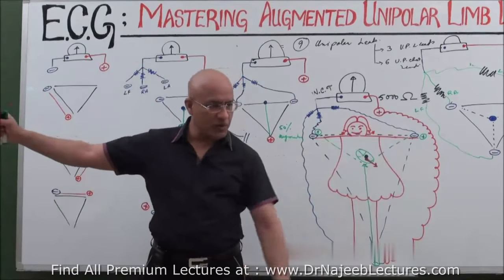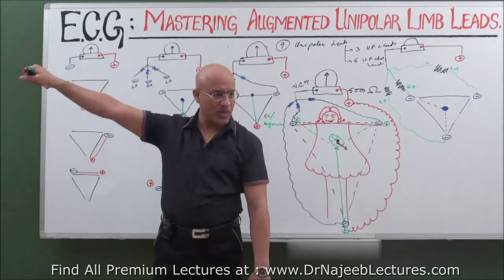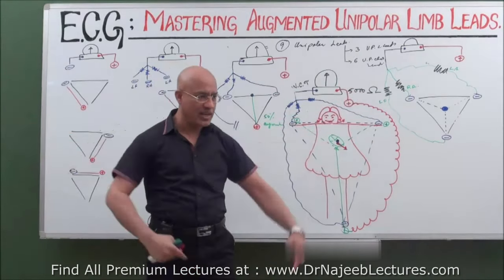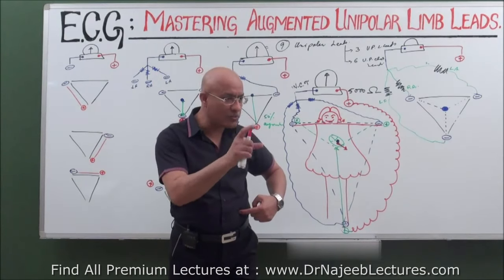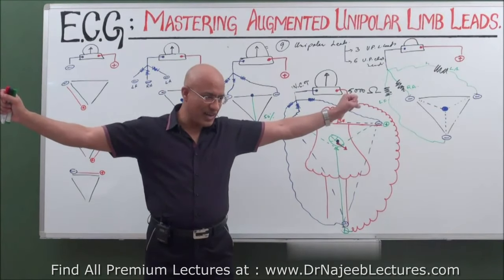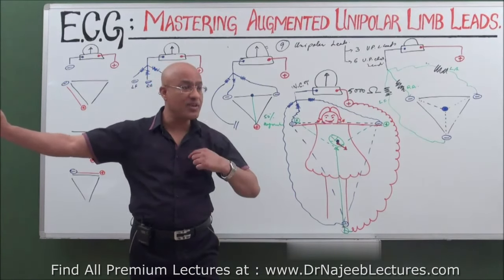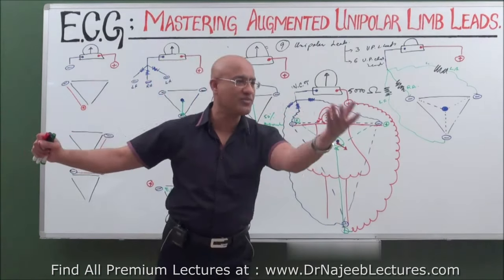Now you understand. If positive is on the foot, listen carefully, if positive is on the foot and negative is here, it is lead number 2. If positive is on the foot and negative is here, it is lead number 3, bipolar. If positive is on the foot and negative is here, here and also on the foot, it will look straight up. But this is new VF. What is this? VF. But voltage is poor. Yes. Another way is you put negative only here and only here. Right? And positive only on the foot. Now it will show the same view which was by the VF, but voltage will be enhanced. So now it will be called AVF, augmented voltage from the foot.